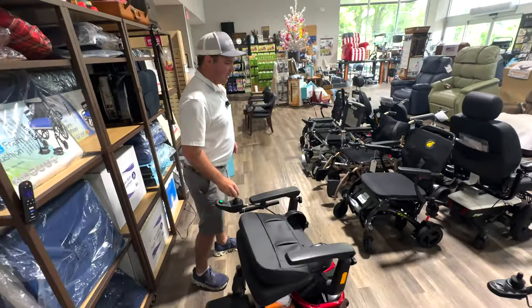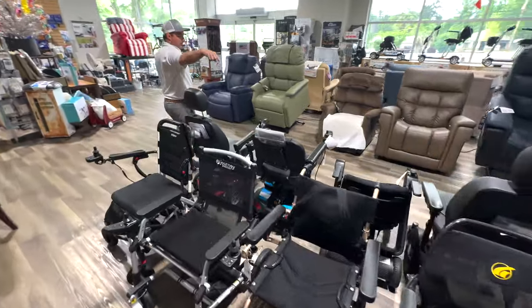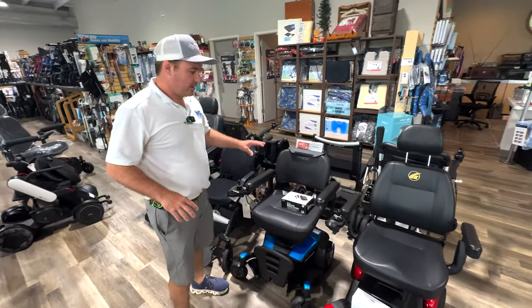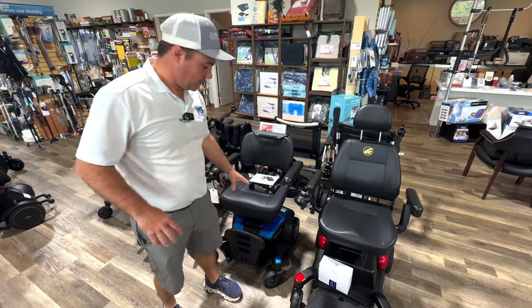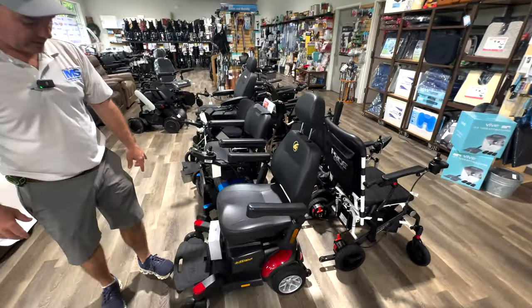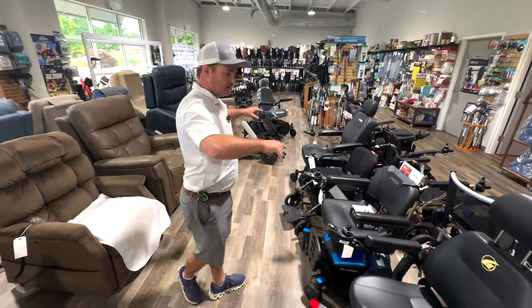So that's the Envy. Something in the Envy class that disassembles like that would be your Go Chair by Pride — comes in different colors, has a little bit smaller batteries, slightly less distance. There are some benefits to the Go Chair. The Envy is nice if you're going to be using it outside as well — the Go Chair has a little bit lower ground clearance. Then you also have the Buzz Around with a higher back seat that also disassembles, with a front light. These chairs kind of stick together in a class because of how they disassemble.